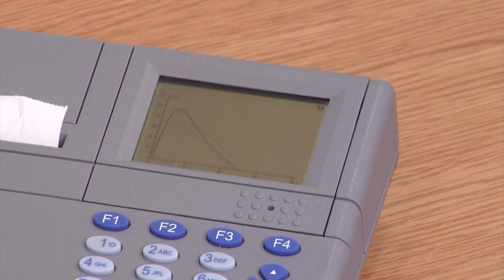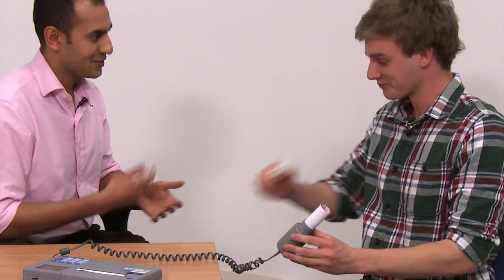Encourage the patient to breathe out all the way and check their technique. That was great, thanks. You can relax while you catch your breath for the next one.